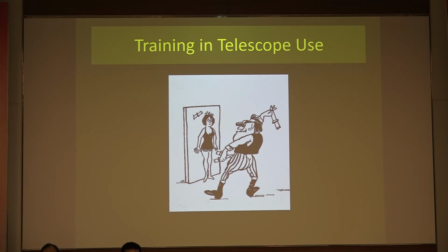And then what I usually do is I have my assistant or my ophthalmic assistant or a class 4 staff take the patient out on the streets and make him use the telescope on the streets. And if he is comfortable in both indoor and outdoor use of the telescope, then we finally prescribe the telescope to him.